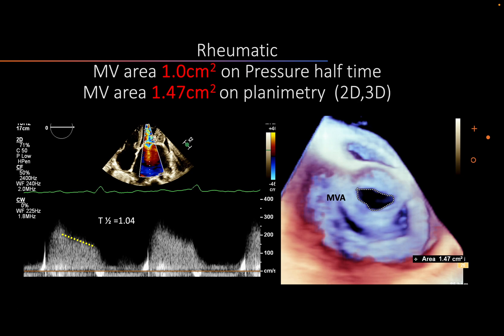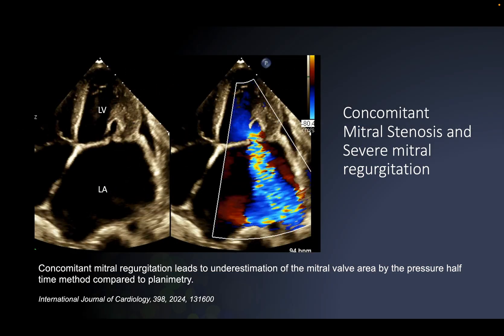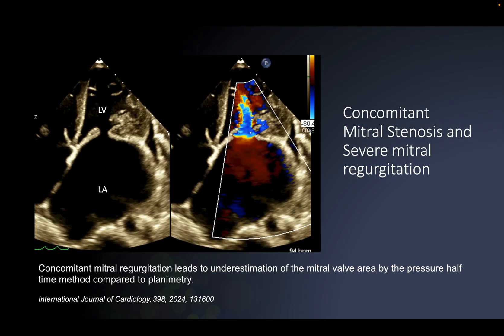A case of mitral stenosis of rheumatic origin with a disparity between pressure half time and planimetry for mitral valve area. By pressure half time, the area is around 1.0, while by planimetry done on 2D and 3D, the mitral valve area is more than 1.4. Why is there a disparity? I am going to show you that the commonest reason for this disparity is severe concomitant mitral regurgitation.